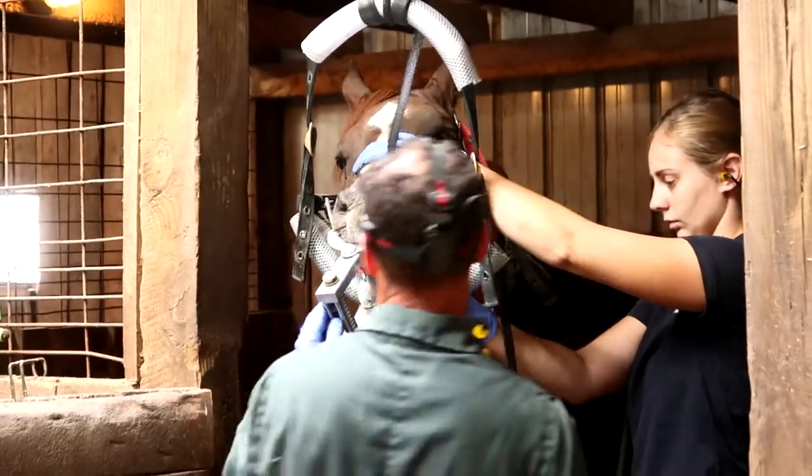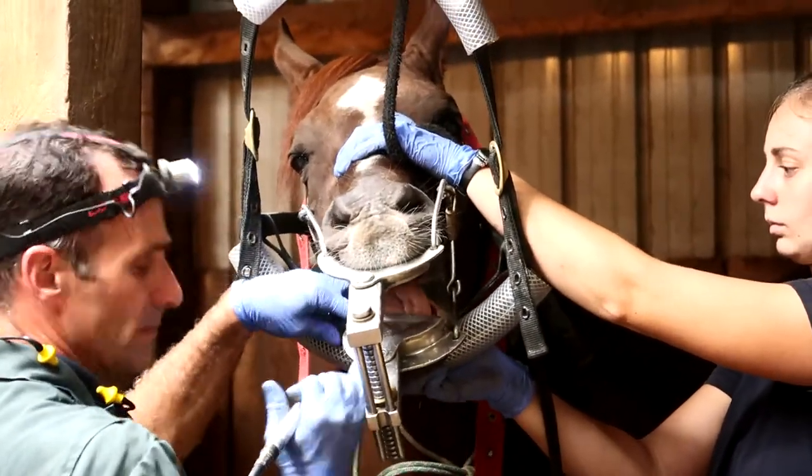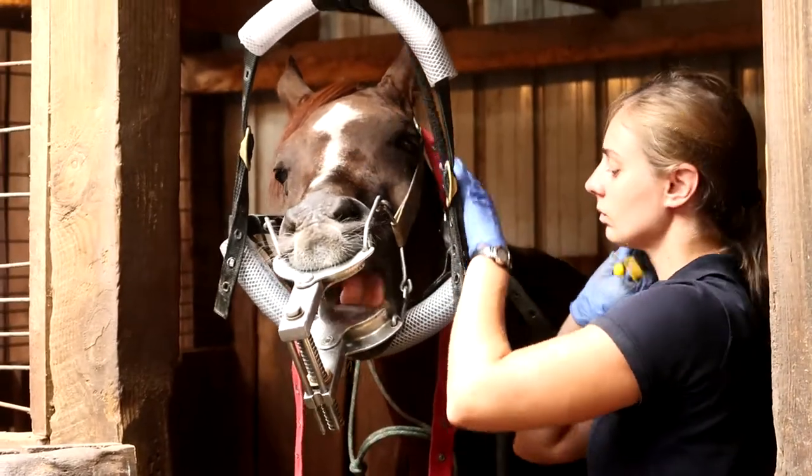Here he's just going to do a quick check to see if he's missed anything, and then he's going to switch to his hand tool to finish up.